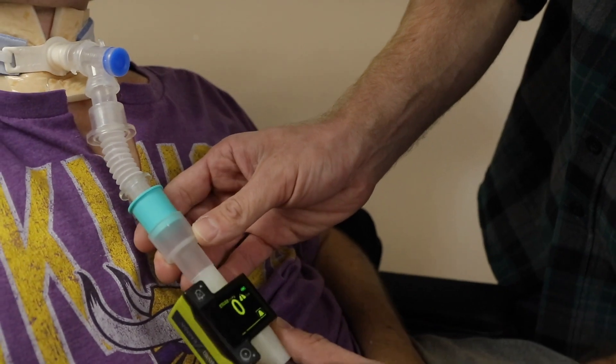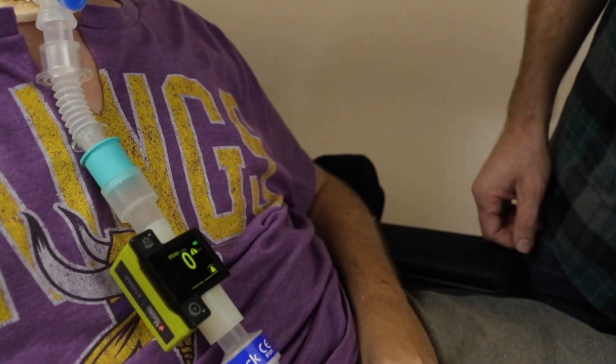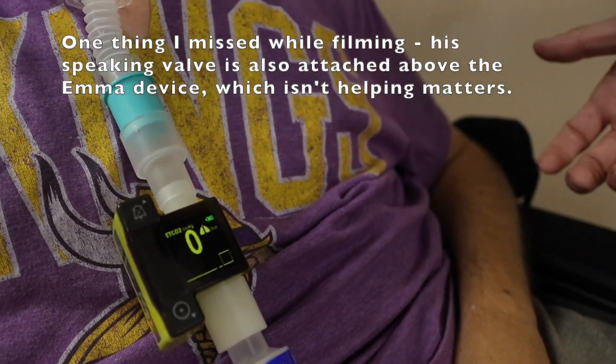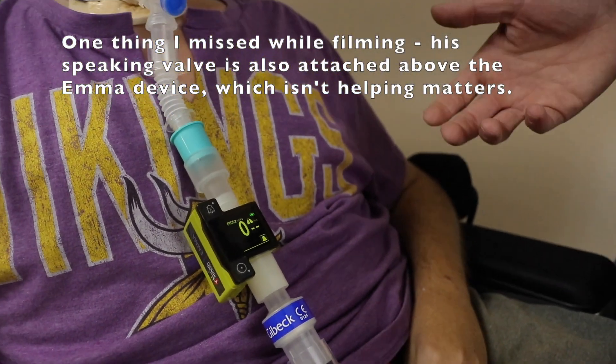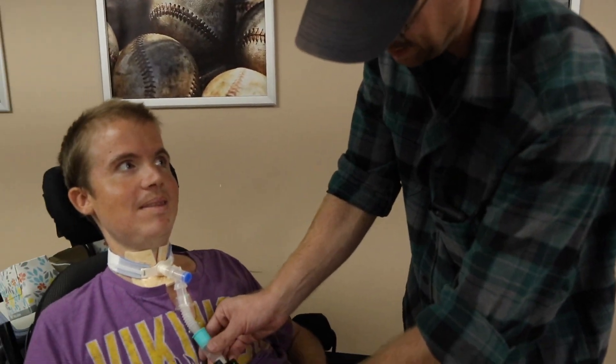The interesting thing you'll note is when it goes on the circuit, even when he breathes, he gets nothing. So there's no exhalation going on in the circuit right now. This is going to be fairly common with vented patients who have the balloon down in their trach, and I'll show you why.